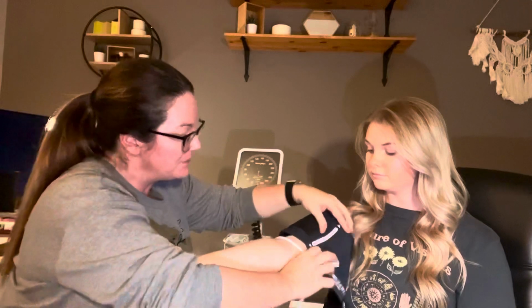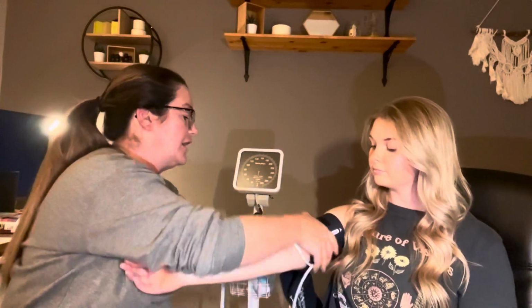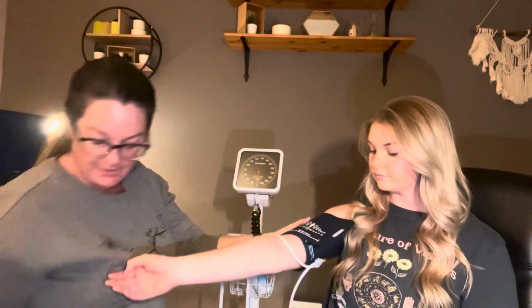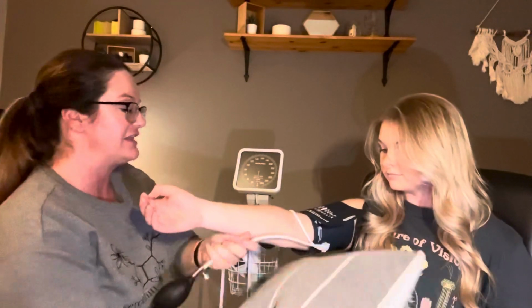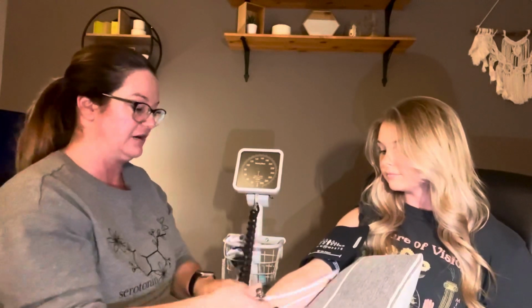So we are going to place it 2 to 3 centimeters above the antecubital fossa with the artery marker lined up at the brachial artery, and I'm gonna secure it nice and snug. I am going to use a pillow to maintain that the arm stays at the level of the heart, okay? And I'm gonna make sure all my stuff isn't tangled here.